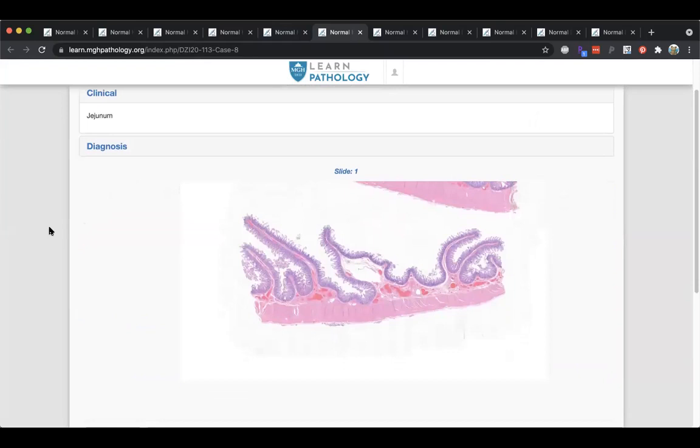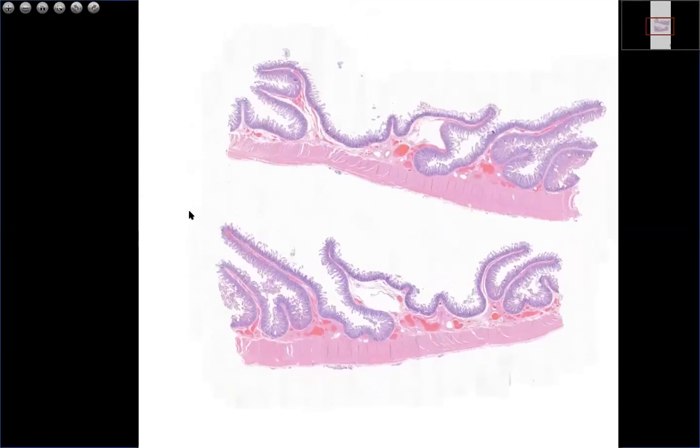All right, moving on to jejunum. We rarely see sections from the jejunum, and this one happens to be from a resection. And the thing that I'll just mention is that as we move further down the small intestine, one thing that happens is that the villi get longer. So whereas in the duodenum, we had a villi to crypt ratio of maybe 3 to 1, here we're getting much longer to maybe 4 to 5 to 1. We wouldn't know exactly that we were in the jejunum, other than that we don't see Brunner's glands and the villi seem somewhat long.